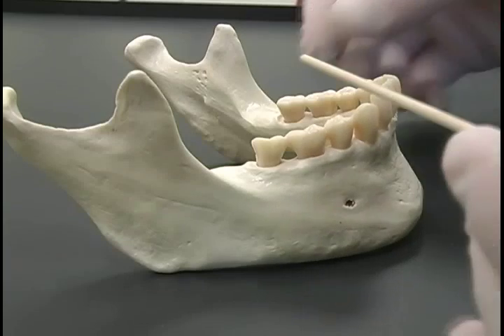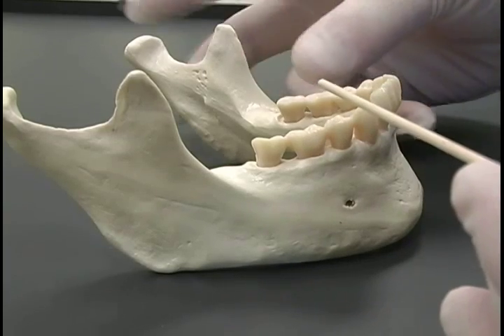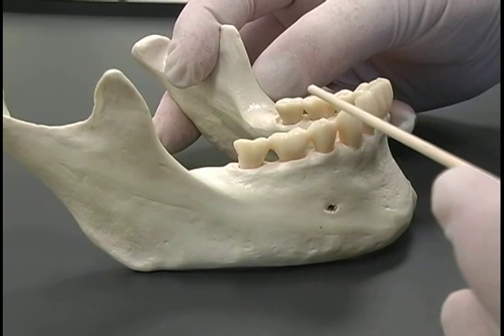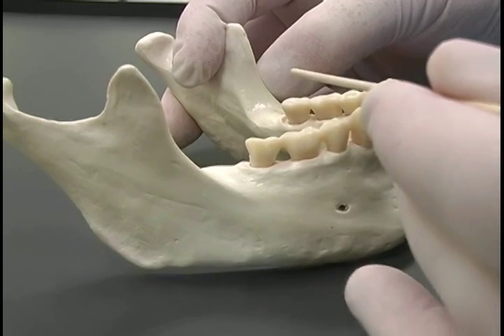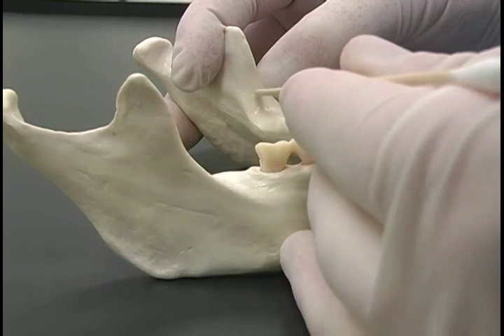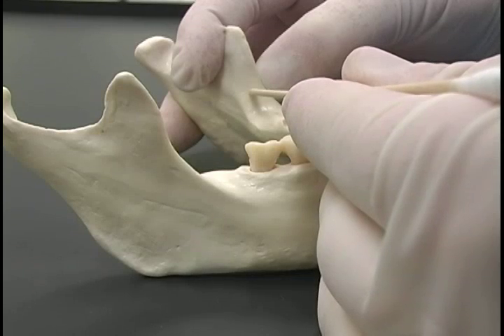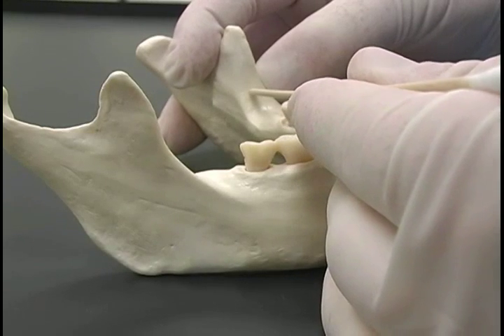When using the external oblique ridge as a landmark, place a finger with the nail exactly at the external oblique ridge like this. Then aim for about five millimeters medial to this anatomical landmark, going one centimeter above the occlusal plane on the average patient.